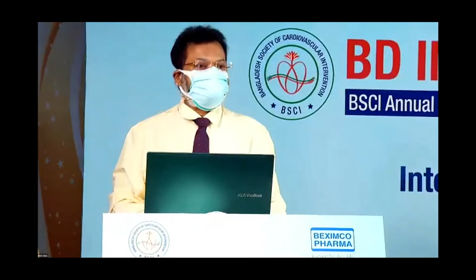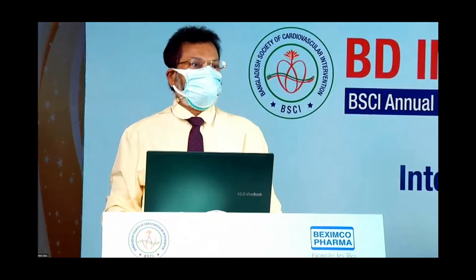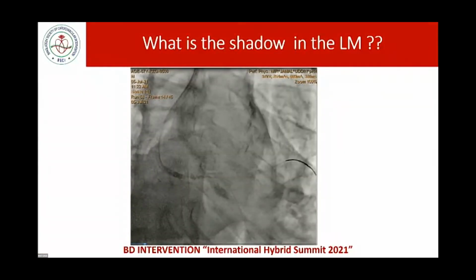Learned audience and participants, sometimes in the cath lab we are in such a horrible condition that we forget the name of my wife, the name of my father. And it is one of those cases. Ghost in left main. I think this can be seen very well.